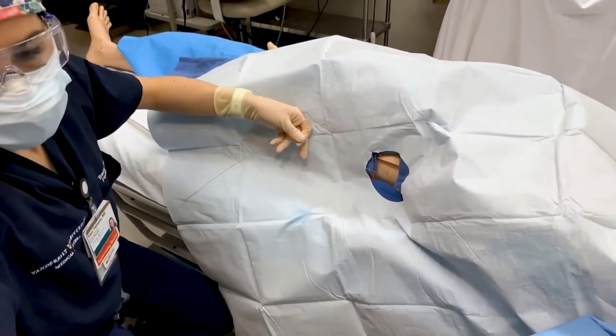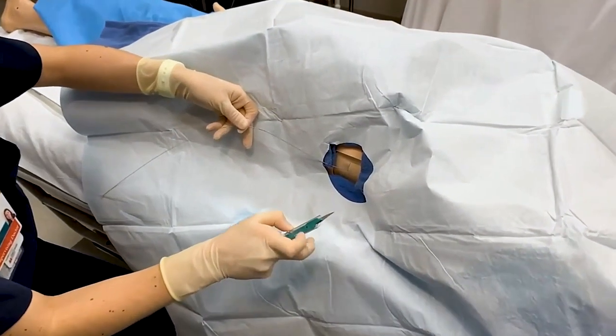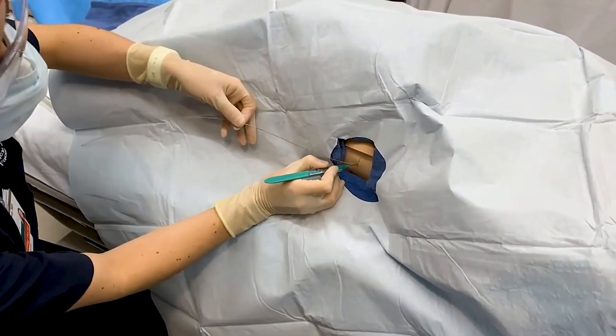Then take your scalpel and make a small skin incision.